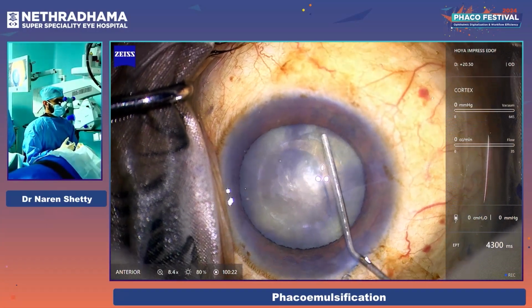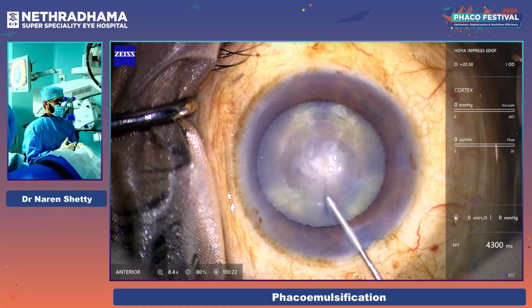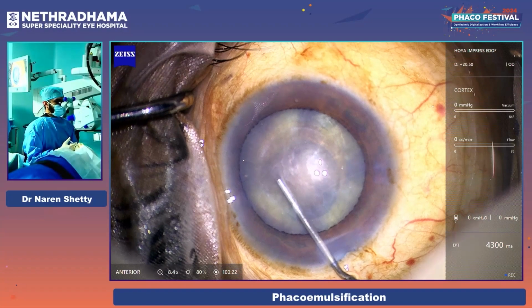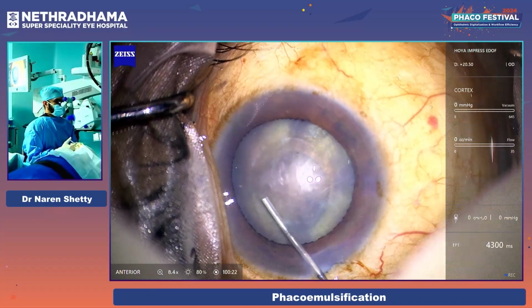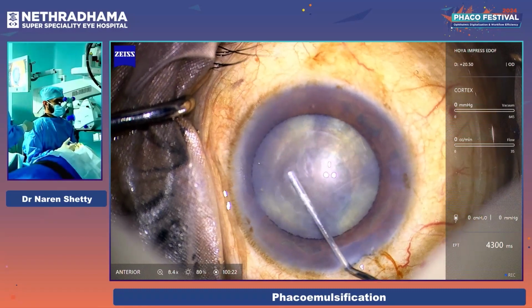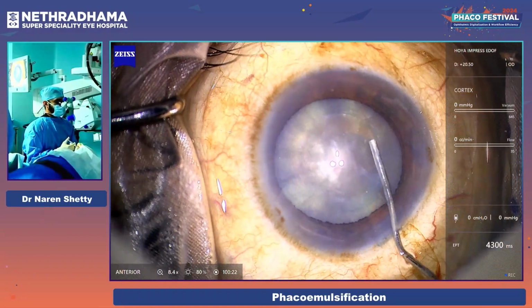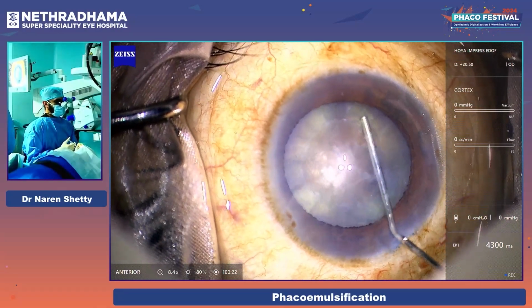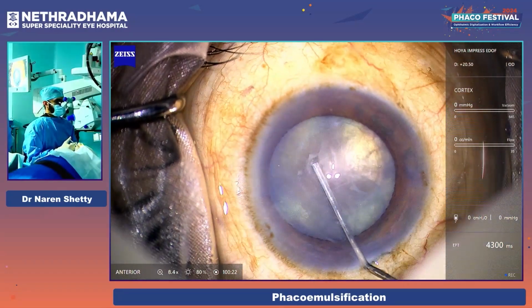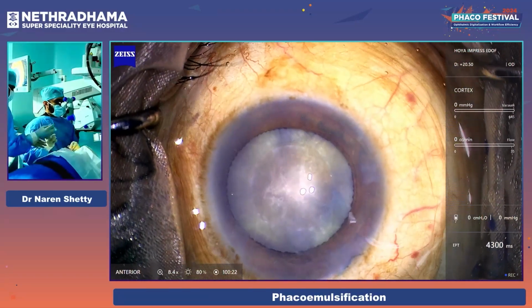Look at the light, sir. So the angle keeps changing. Like Dr. Ron was saying, you can see that wave here, and then you can see the second wave. Now look at the same area now. Look at the light, sir. Can you see the second wave? That's it. So once you've got the second wave, you're good to go. Then you can continue with your phaco.